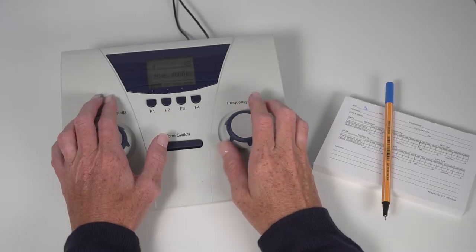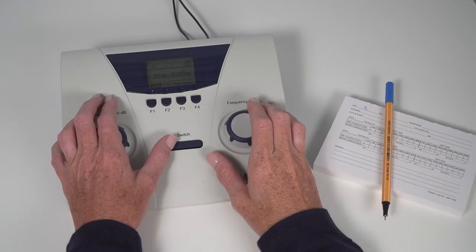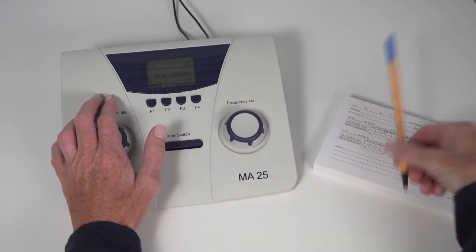Set the frequency to 2000 Hertz and repeat tone presentations at the screening level. Document the response. Continue on with this method until all frequencies have been tested for both ears.